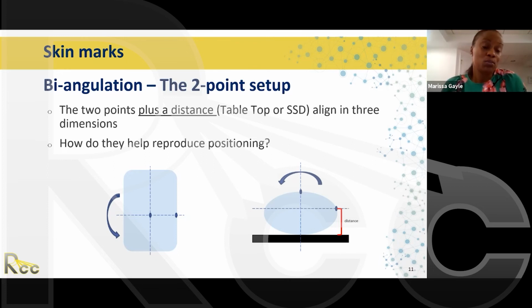In the past, before we had this technology, we went on, yeah, my bladder is full, but there was no way for me to know when I was working on a Clinac 6. And we took a film just once a week. But now that we can do imaging daily, we're able to see if the patient's bladder is full and their rectum is empty. And if it's not, we take them off the table and I will either give them something to drink or ask them to please use the bathroom.